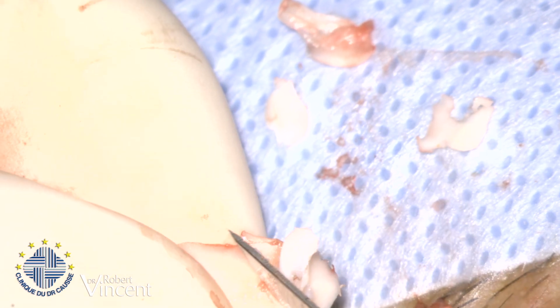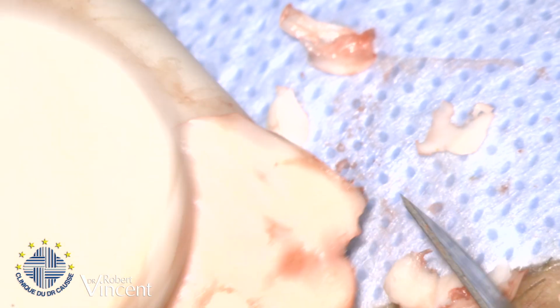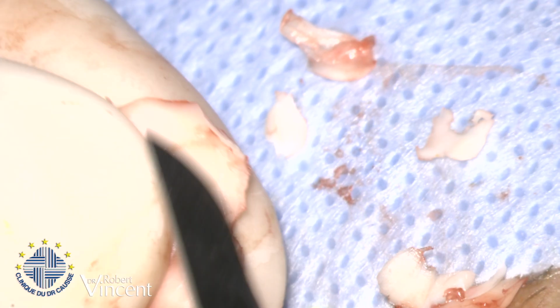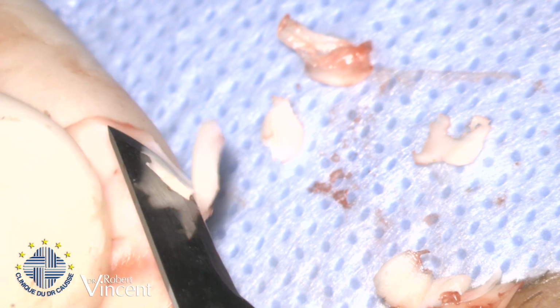It's becoming soft, so this I can remove. I think I need to trim on the other side also a little bit. It's becoming much more flexible now. It doesn't curl inside, sometimes it just curls inside.